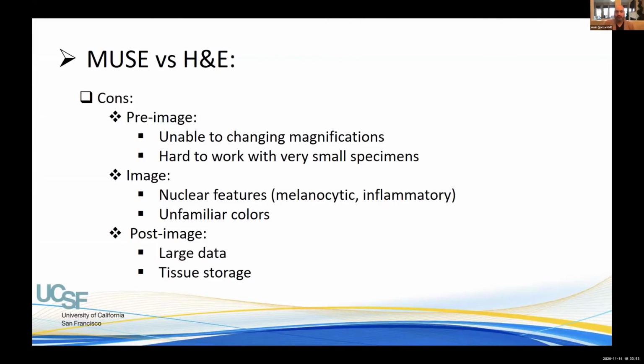But very small pieces, like less than a millimeter in size, it was difficult to put it on the slide and keep it to not move while we are examining it. But we had this problem with very small specimens.